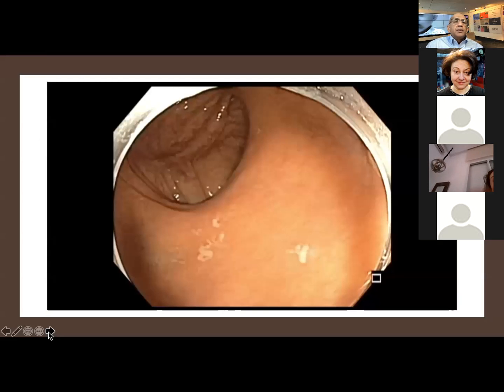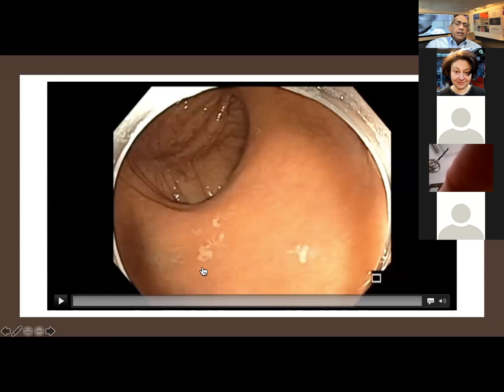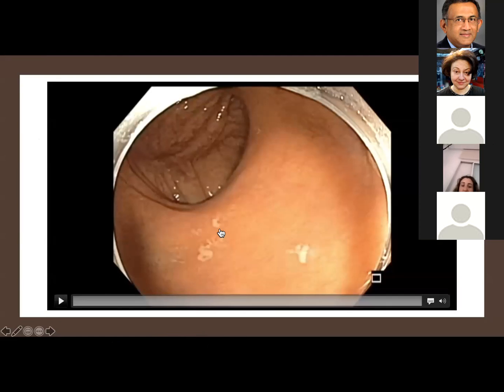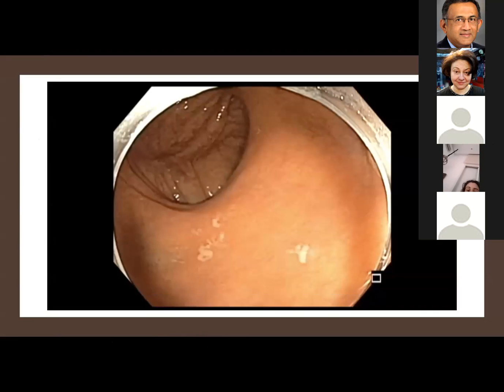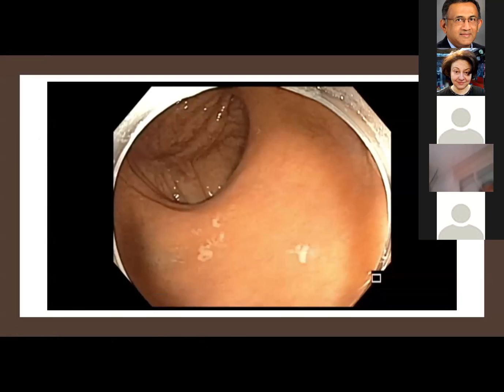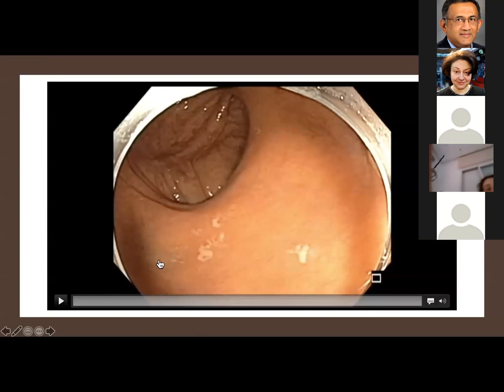So what I'm going to do is share with you the first video that is showing the lesion that he wanted me to resect. And in this session, we're not going to talk about resection of that lesion, but I will present that for our group to comment on what they think about that lesion.